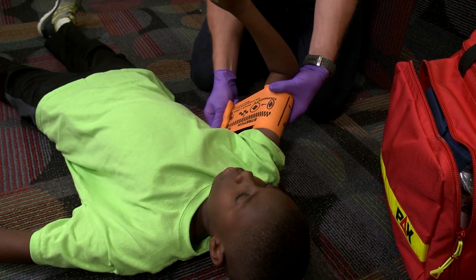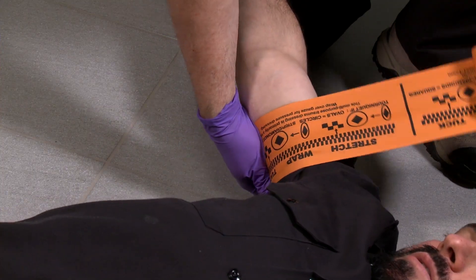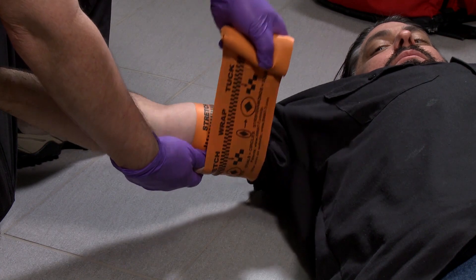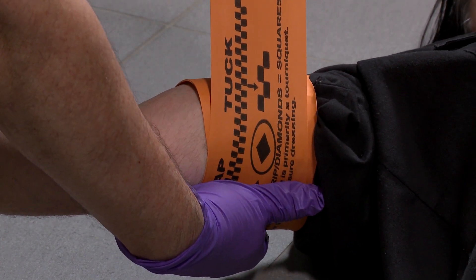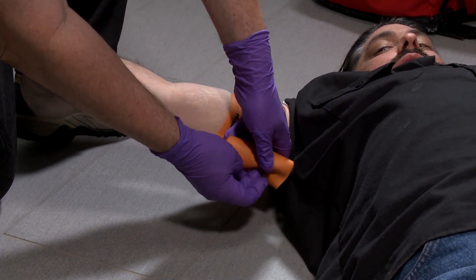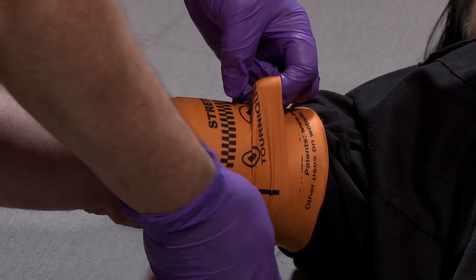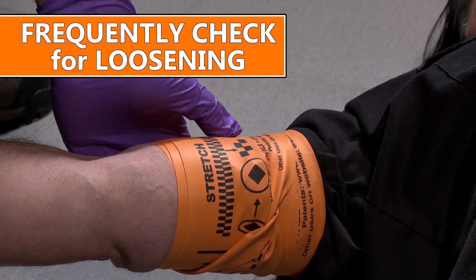The SWAT-T is ideal for children because windlass tourniquets are often less effective around such small limbs. Wrap the SWAT-T above the wound area, or over the wound area if you're using it as a compression dressing. Wrap once around the extremity to ensure the tourniquet is secure against the skin. Pull the SWAT-T tight against the extremity until the graphic diamonds on that tourniquet become squares, which indicates that enough tension is being applied to stop severe bleeding. Continue to wrap the SWAT-T around the extremity, maintaining the compression by continuing to pull the tourniquet while wrapping. Once near the end, hold the last wrap up to create a loop and tuck the end of the tourniquet under this loop — the SWAT-T will grip onto itself and remain in place.